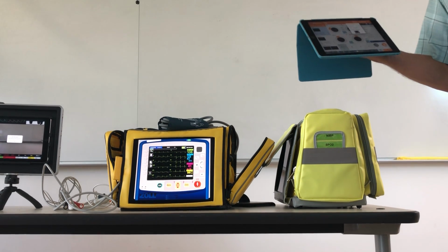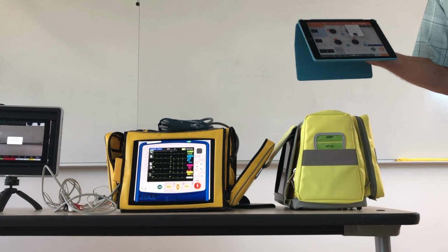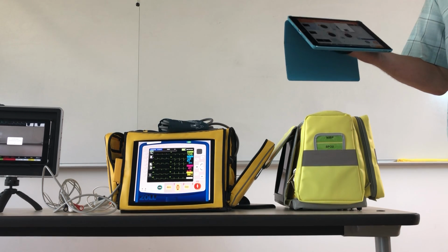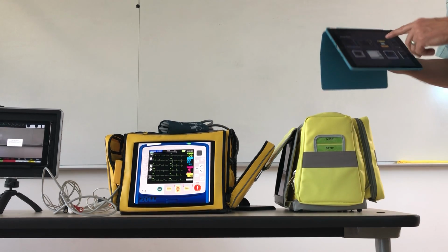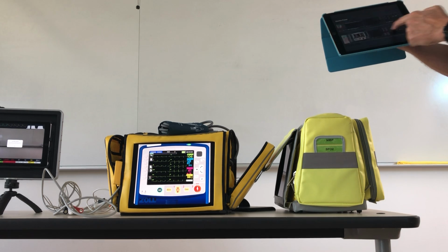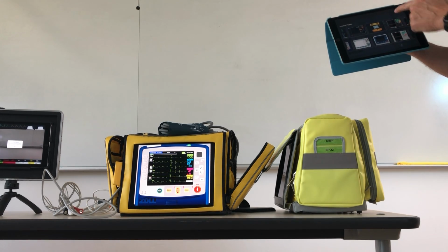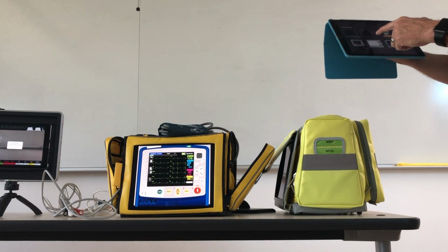So what monitors are being used in this area? Is it mostly Zoll, LifePak, a mix of all those? Zoll, you guys have Philips. Philips, we have that one too. Mostly Zoll. Okay, so the Zoll, I can just stick with that. But at any point, you can switch monitors from within a scenario and pick from any of the different ones. So we have Philips, a couple of different Philips monitors, a couple Zolls, a variety of them.